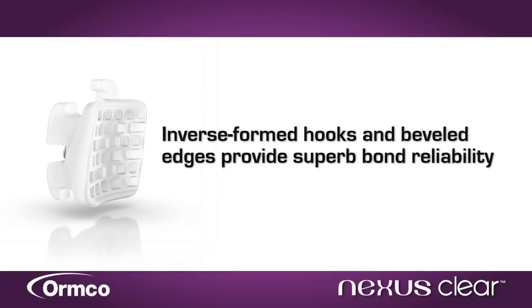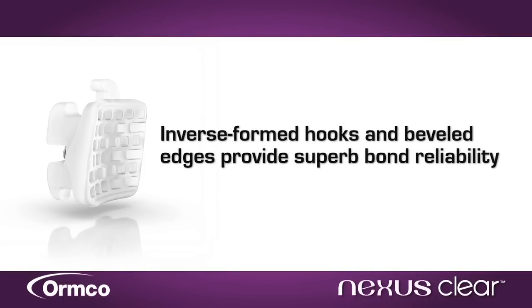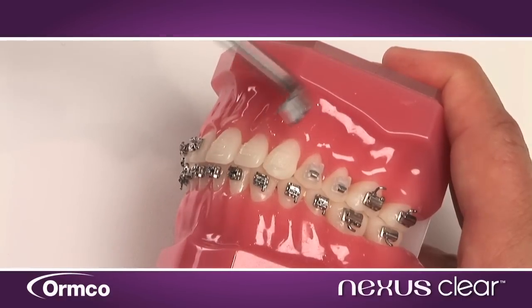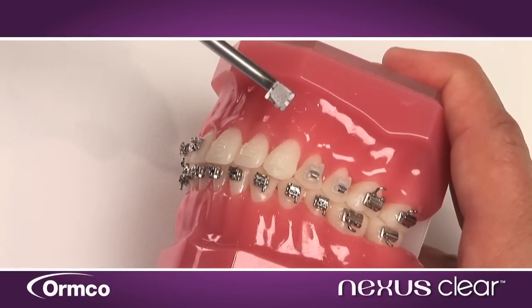you benefit from a strong bond all throughout treatment, while a specially designed Nexus Clear debonding tool helps ensure a fast, efficient, and comfortable debonding experience for patients.